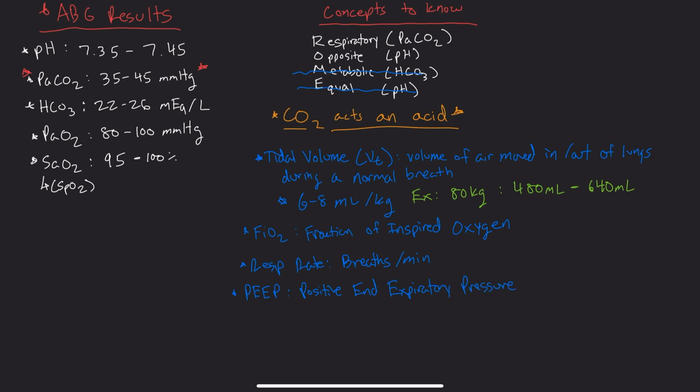So what PEEP is, is the pressure that remains in the lungs at the end of expiration, or following expiration.